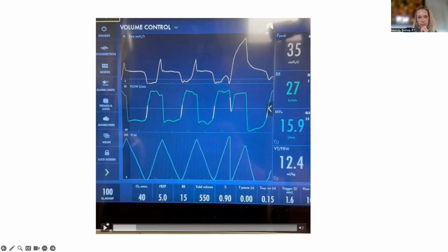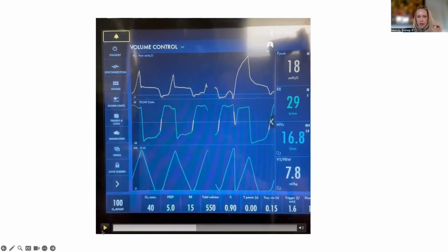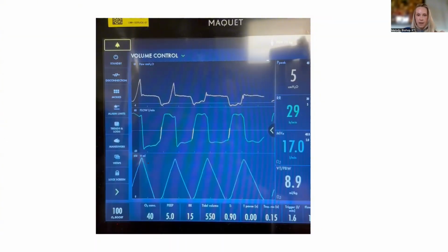And what else? Anything else you look at, Melody, as far as settings go? Well, just a couple things also with the predicted body weight. We have it right there on the screen. That's mL per kilo predicted body weight. You can tell that breath to breath, it's going way beyond what is considered safe. One thing that I just want to draw everyone's attention to is looking at what is set. And Nick just mentioned the settings. These are what most of us in the vent world, especially people that are new to vent, see as safe ventilator settings, normal ventilator settings. And yet we have very dynamic, complex waveforms that are showing us that the patient is tortured. And this is a key takeaway message: just because your settings are safe does not mean it is actually safe for your patient. Because this is where the waveforms start to come in and why it's so important to start to move through a basic understanding of what waveforms should look like.